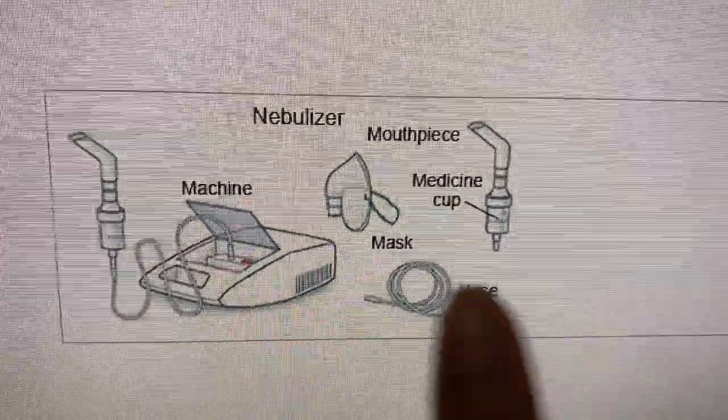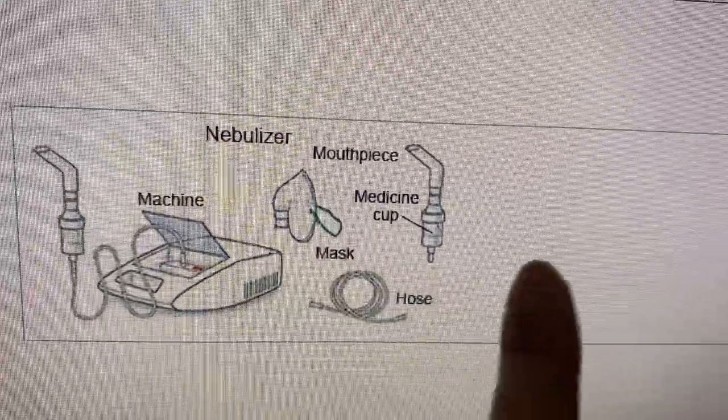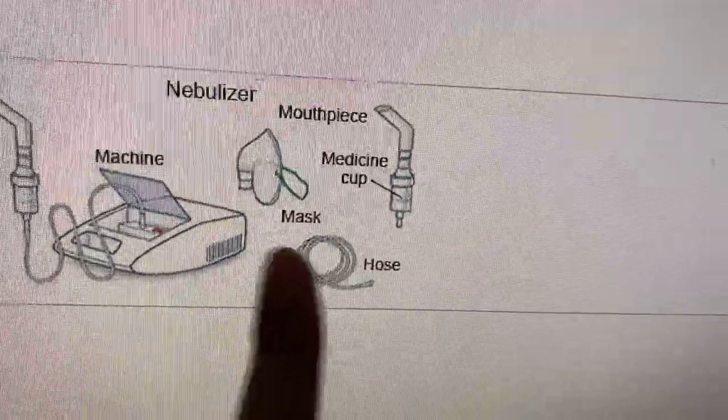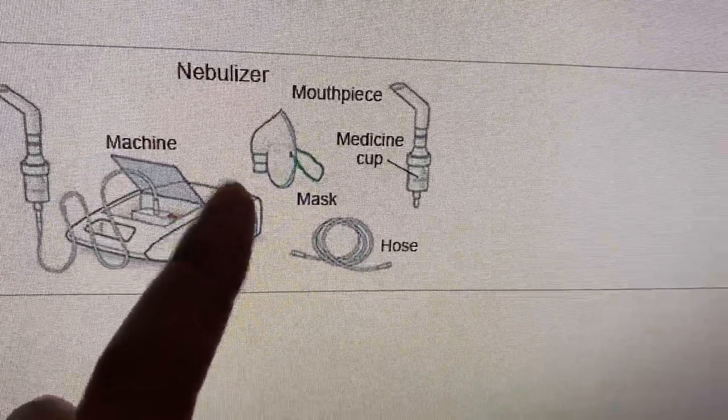So, ayan. Ito yung machine natin. Ito yung face mask. My mouthpiece. The medicine cup or the medicine bottle. Then, the hose. Yung face mask natin, may pang-infant siya, pediatric, and pang-adult.